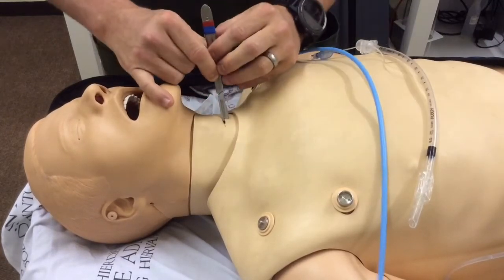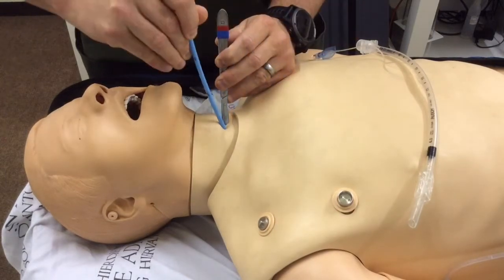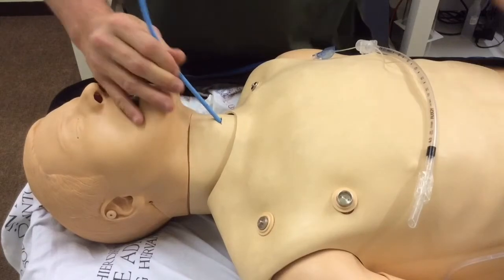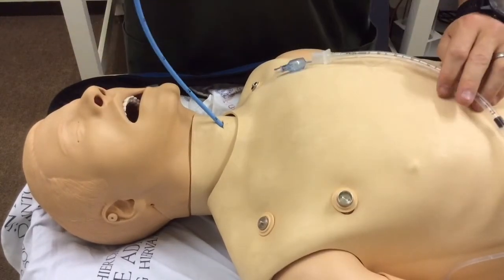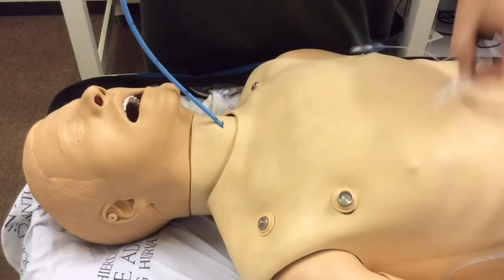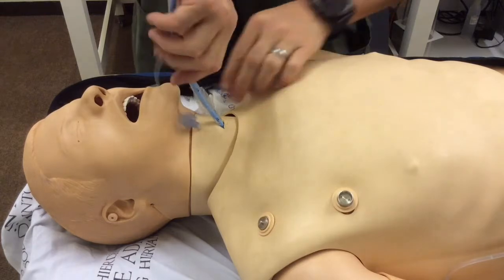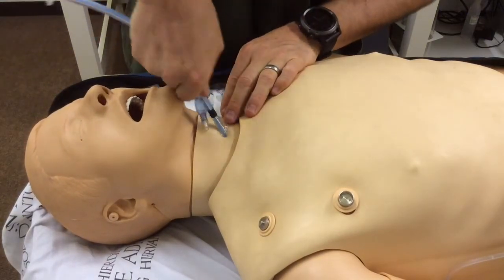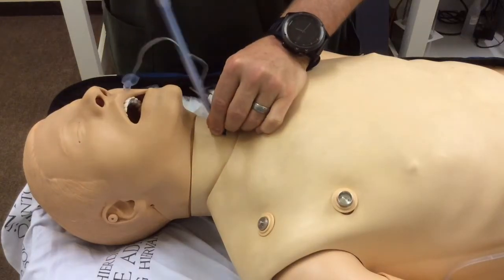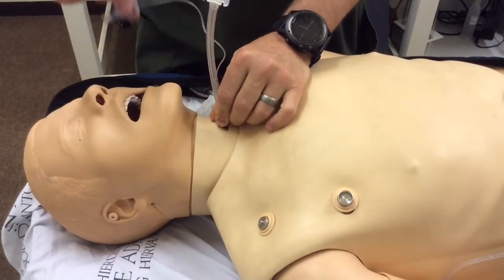At this stage I like to work with my dominant hand. I'm going to swap hands and, using the coude tip of the bougie, I'm going to pass it down the trachea and it should move freely. I can now remove my scalpel and make it safe. Confirm that my bougie is moving freely. If I've got a hollow core bougie I can already oxygenate at this stage; otherwise I'm going to connect and railroad my size 6 tube with a slight screwing motion if I have to, to get it in just until it's into the trachea. Out comes my bougie and now I can connect and oxygenate the patient and inflate the cuff.